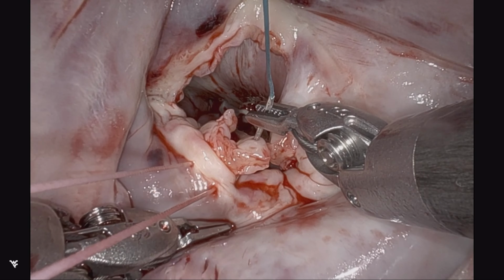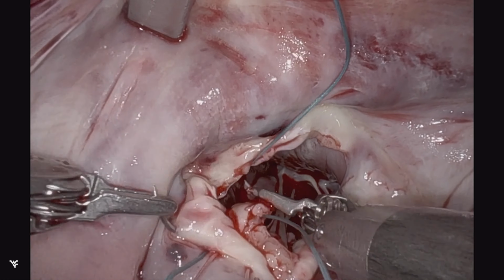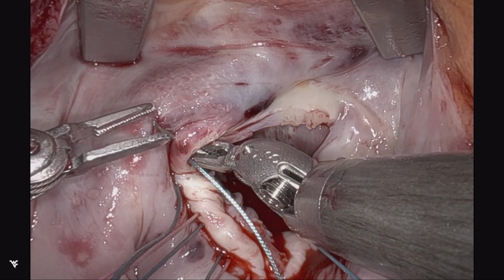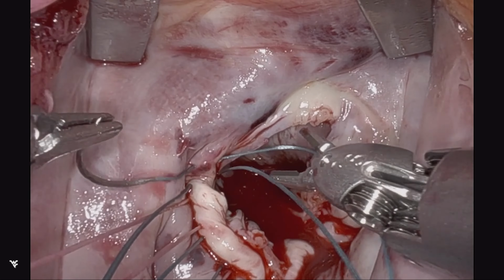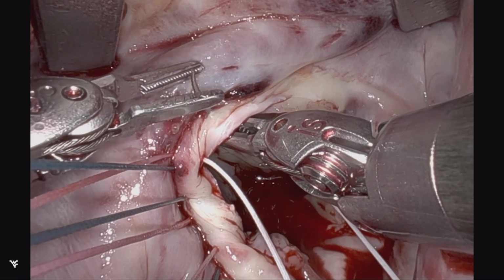And then subsequent to that, our annular bites are utilized to incorporate all of the tissue in a circumferential fashion. Now, it is important to note that the reason we don't use pledgets as our preference is that we want to optimize and get the largest valve possible. Another reason why we approach this from the ventricular side as opposed from the atrial side.